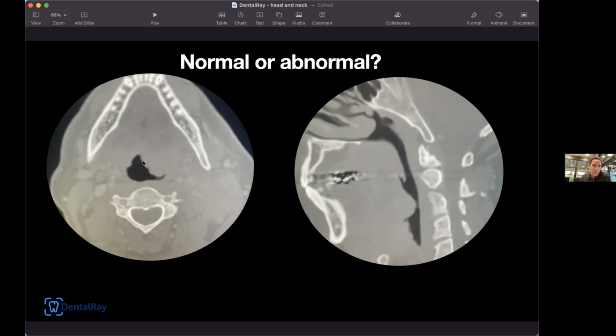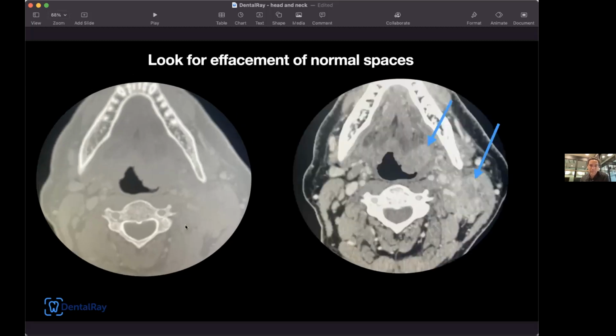So in this case, we're looking at the oropharynx, obviously, and this is probably a view that's familiar to a lot of people that are doing CT, where you're looking at the airway and you're assessing for airway stenosis. You can see this abnormal rounded contour here at the base of tongue. And the oropharynx, you can see, should look like this on the right side with that smooth contour. And here it's irregular and nodular with this exophytic contour pooching in and effacing the air. The air, remember, Hounsfield units is very low in density and looks black on CT.